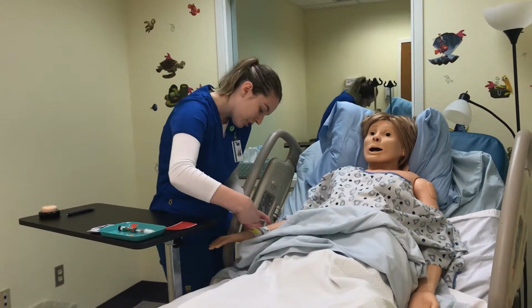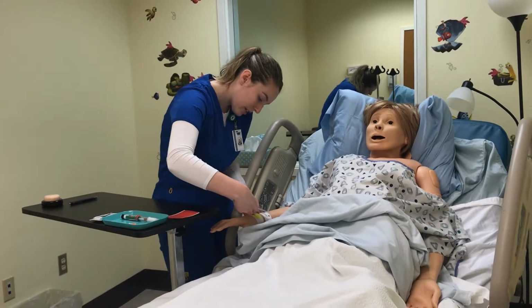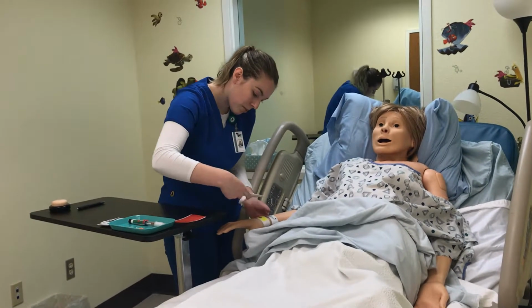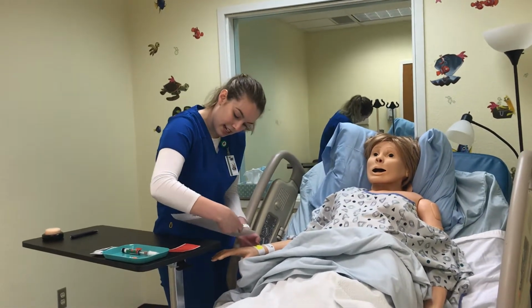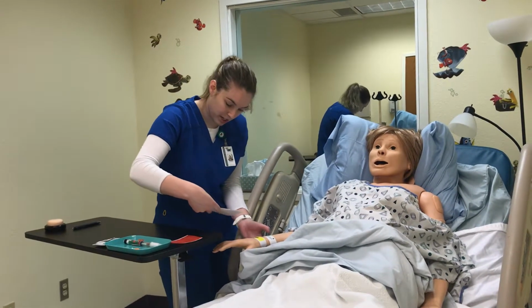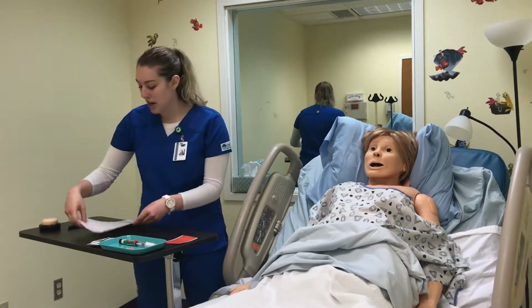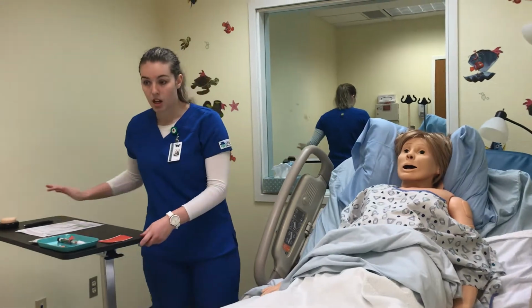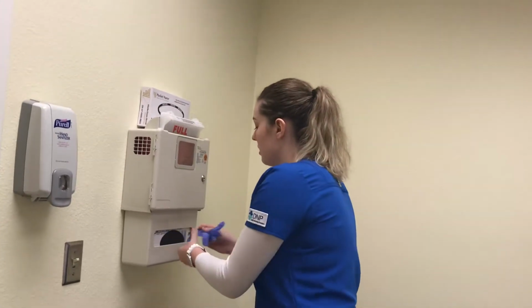Okay. Shirley Coast, 54, female. Good. And your date of birth? 5/14 and 64? 5/14 and 64, perfect. And do you have any allergies? Codeine, yeah, I see that. And it does say that on your MAR and your wristband, so that's perfect. So your MAR matches up with the patient's wristband, so I have the right patient. I'm just going to do some hand hygiene and grab my gloves so I can administer my insulin.